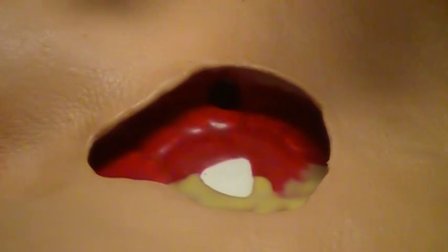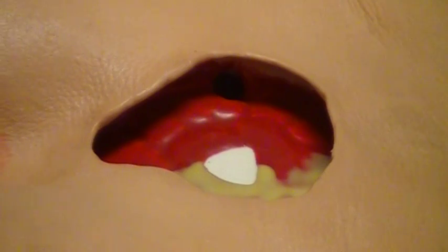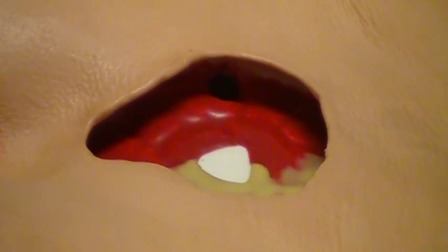Now, this is an open wound, so really what I'm concerned about is, are those edges edematous, or are they staying too moist? You'll hear a term called maceration. We probably discussed that term in the first portion of this lab. That means those wound edges are staying too wet. And so we'll want to make sure that when we're putting that wet to dry dressing in there, that we're not leaving that dressing too wet. If those wound edges are looking like wrinkled skin or wet skin, that would be a good indication of that.